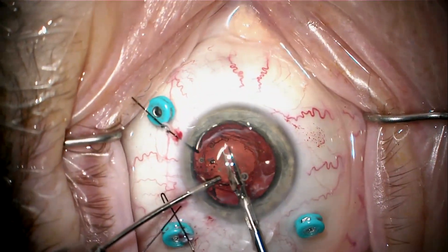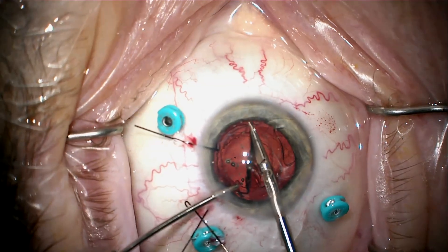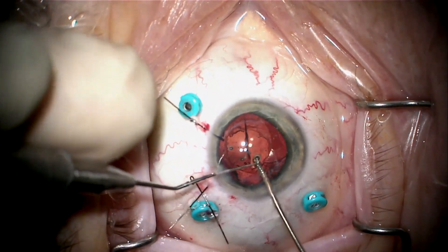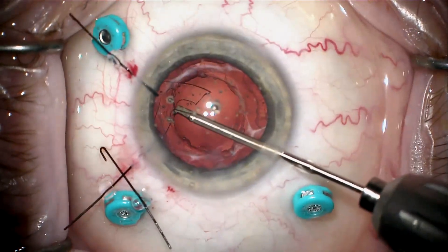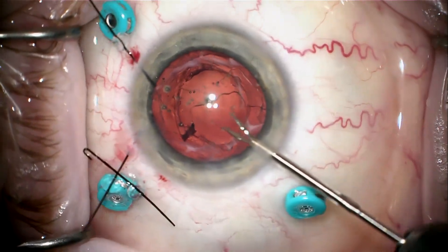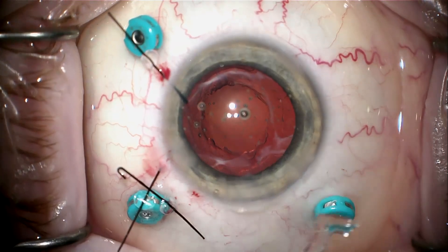I'm going to go ahead and cut this in half and remove it through the main incision. These hydrophilic acrylics are very soft, so that's one nice thing about taking them out — getting them out of the bag is really tough, but they cut easily. I'm going to remove this last remaining haptic by cartwheeling it out of the fibrotic tunnel it was trapped in. This way I don't put any stress on the capsular bag or the zonules. And now the whole lens is completely removed.